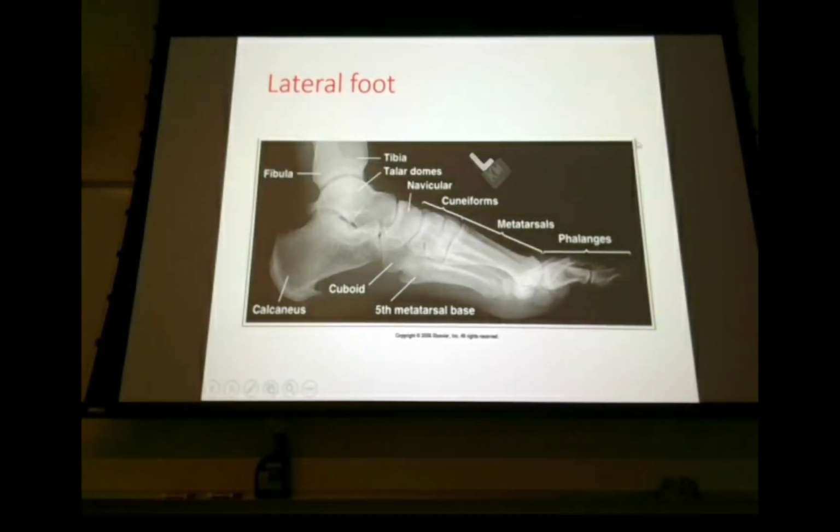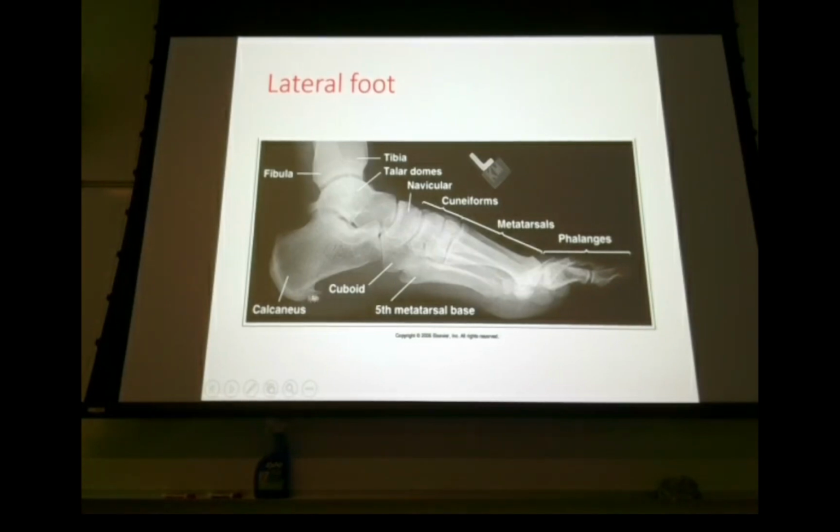So that's what it should look like. Note still that we don't have perfect superimposition, but that's a pretty good lateral foot. Maybe a little bit of bone spur there. Sesamoid bones, you don't visualize them all that well. But the fundamental difference between lateral foot, lateral calcaneus, and lateral ankle is central ray location and collimation. They're all positioned exactly the same, so we're not going to stop on each one of those and talk about all the particulars of all of them. Fair enough?